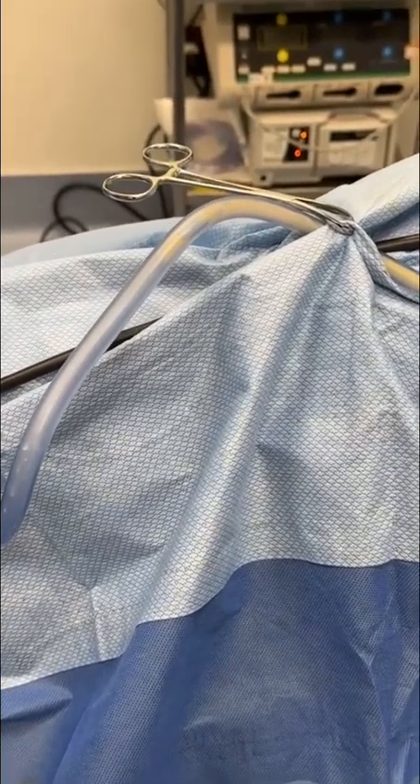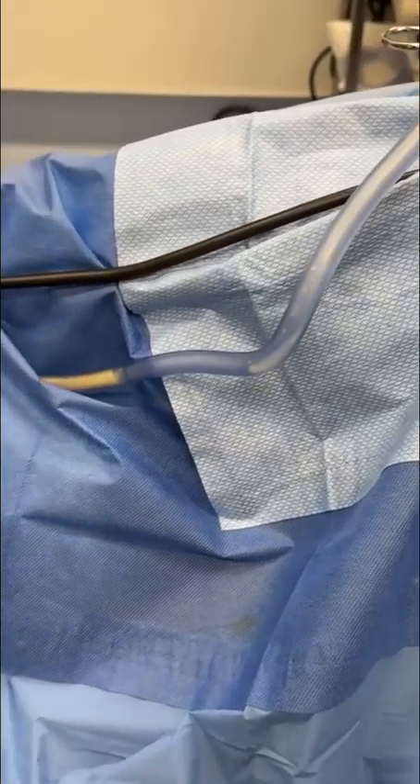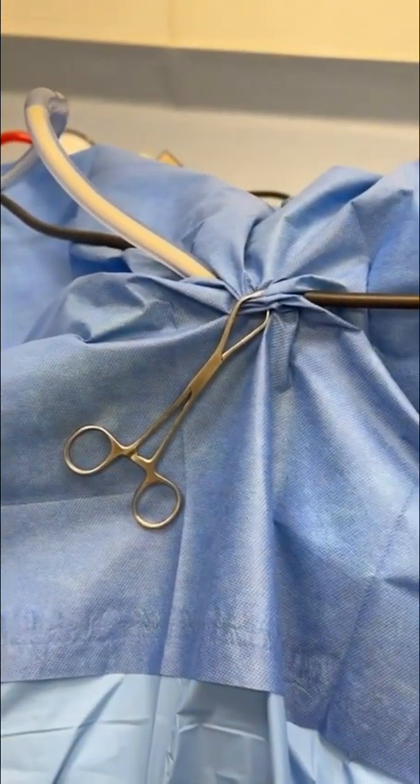Dr. Patino here at the Cosmetic Surgical Center of El Cerrito. Look at that — this is a beautiful yellow pod without even a speck of blood. This is going to go into her buttocks.